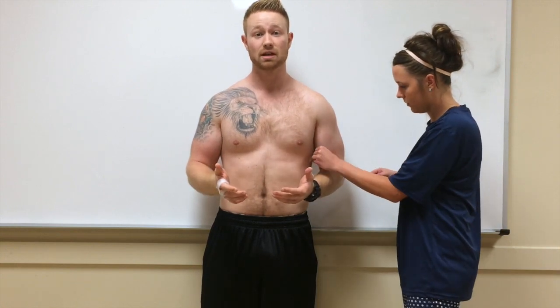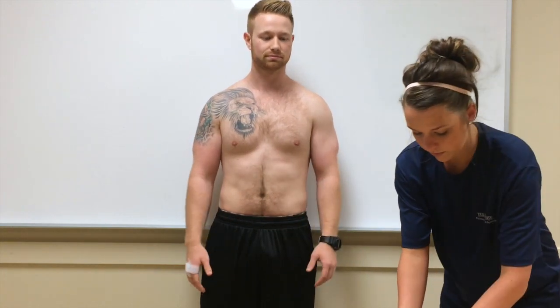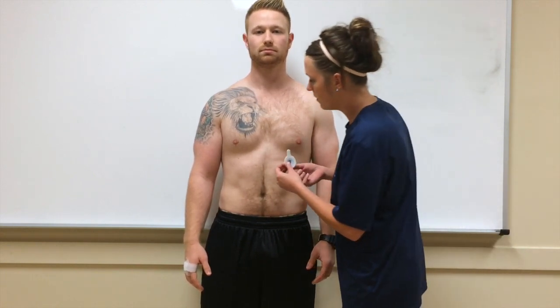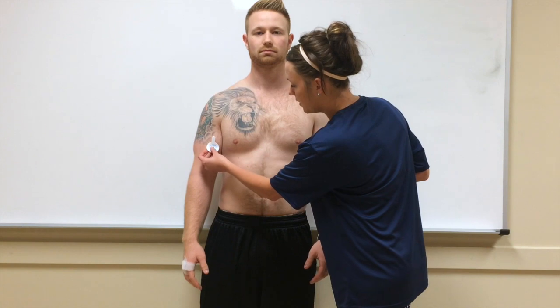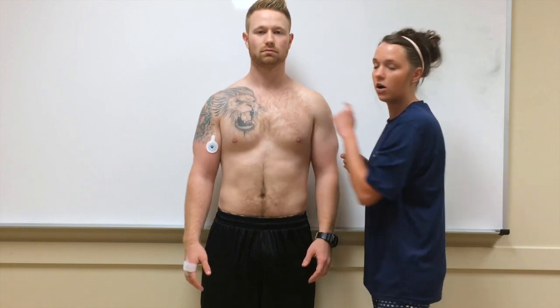When beginning the electrode placement, you want to start from the outside, from the limbs, and work your way in. So the first ones will be the arms. I'll start with the right arm, placing this first electrode right there on the bicep. If your client is a little bit larger, or maybe a paraplegic, you can also place these two arm limb electrodes right here on the shoulders.